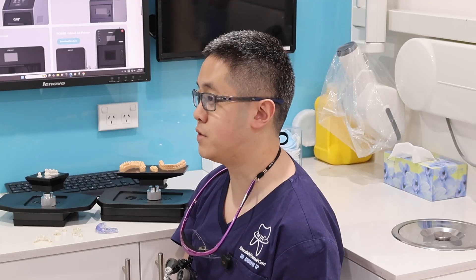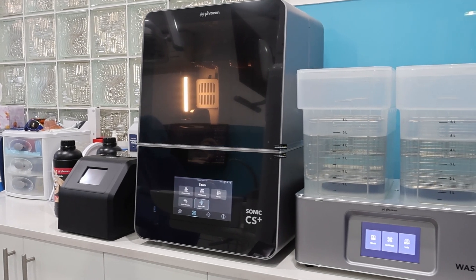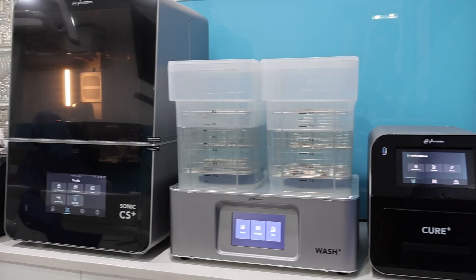I've used over 35 different 3D printers, and the CS Plus ranks really highly amongst them. G'day, I'm Dr. Andrew Ip, based here in Sydney, Australia. I'm a general dentist and I have a particular interest in 3D printing in the dental industry.